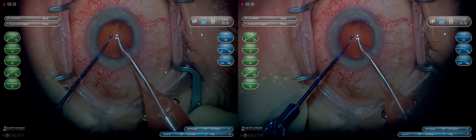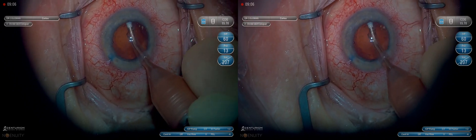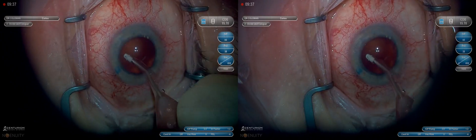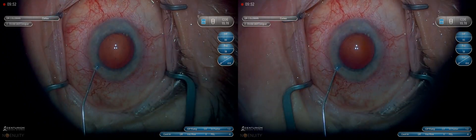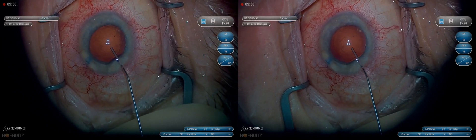As usual in this case with a dense cataract, there's not hardly any cortex remaining. Be real gentle with removing it — sometimes the posterior capsule is brittle and can be more prone to rupture when a nucleus is that dense. I injected a little ProVisc through the paracentesis wound to make sure that there were no remaining fragments there. If there were, I'd rather find them now rather than when I hydrate the wound at the end of the case.